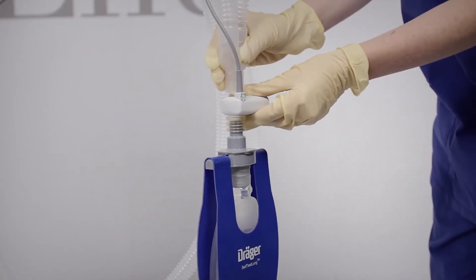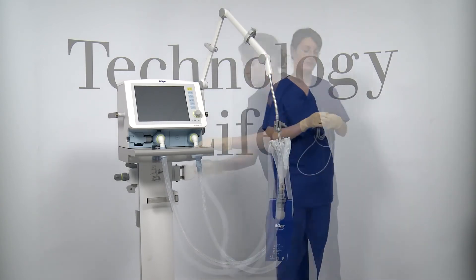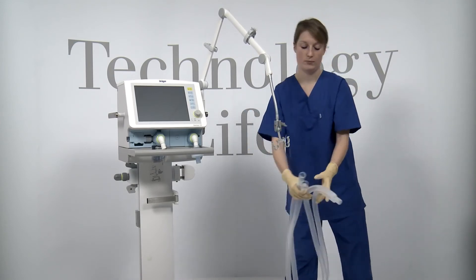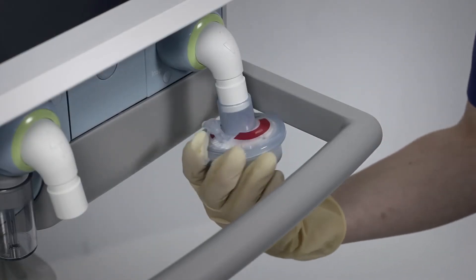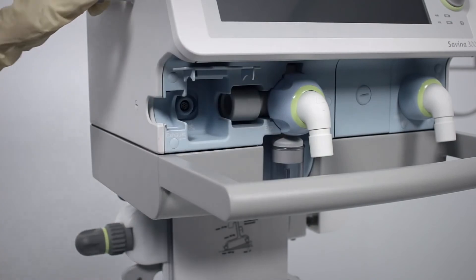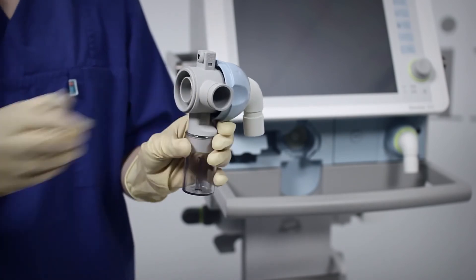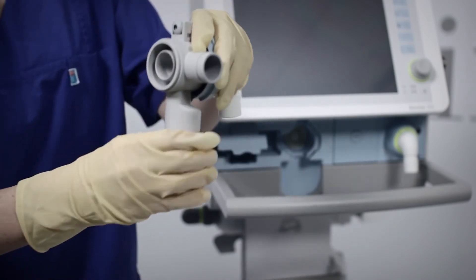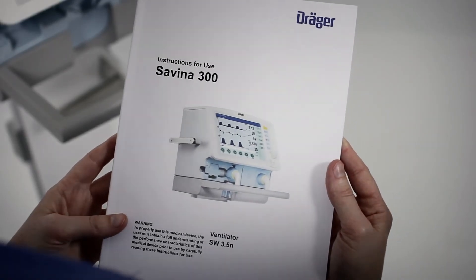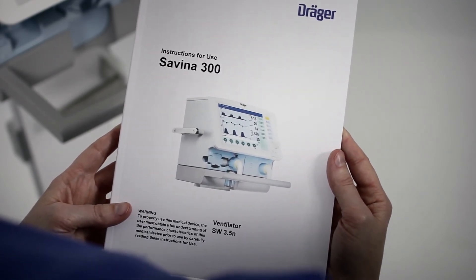Now remove the CO2 sensor. Please note that only reusable cuvettes and sensors can be reprocessed. Remove the breathing hoses, the bacterial filter, and the flow sensor. For the expiratory valve, pull the flow sensor sleeve from the expiratory valve and remove the diaphragm. Remove and empty the water trap container. If a medication nebulizer was used, dismantle it in accordance with the corresponding instructions for use and reprocess the components in accordance with the reprocessing list for semi-critical medical devices.